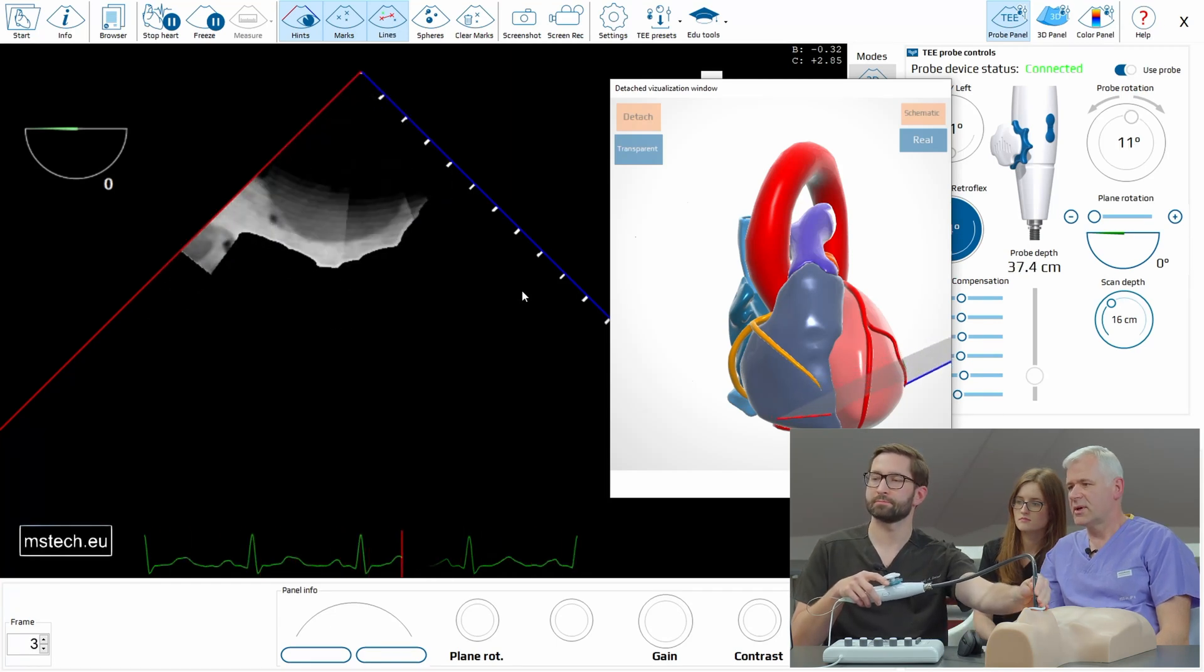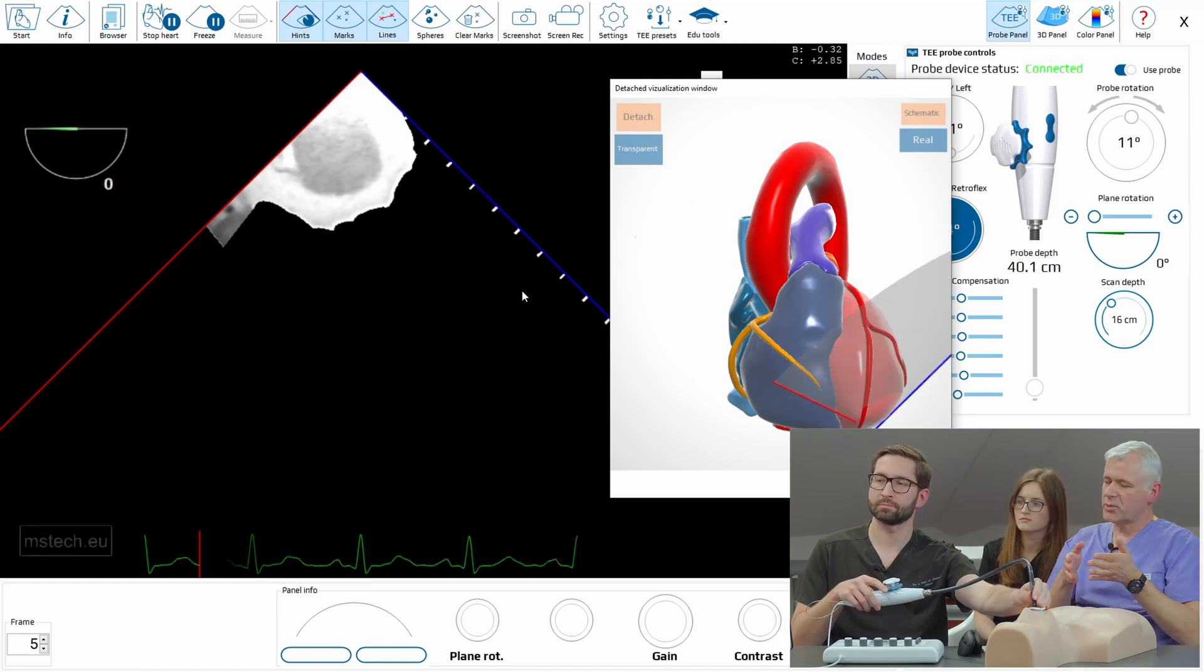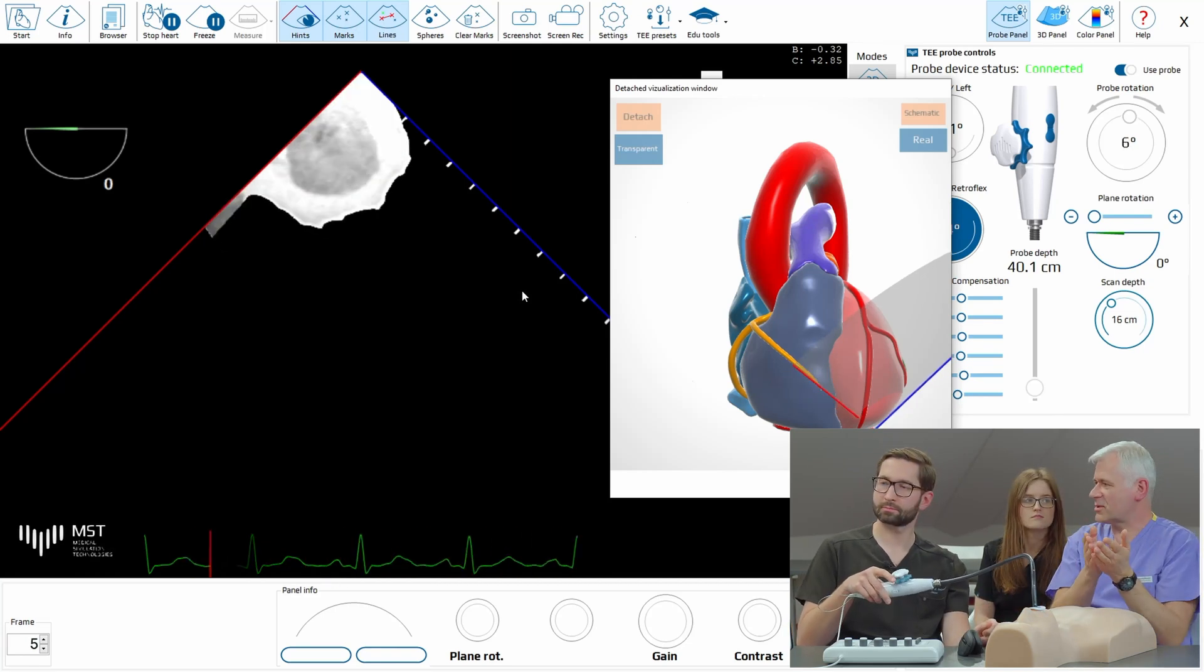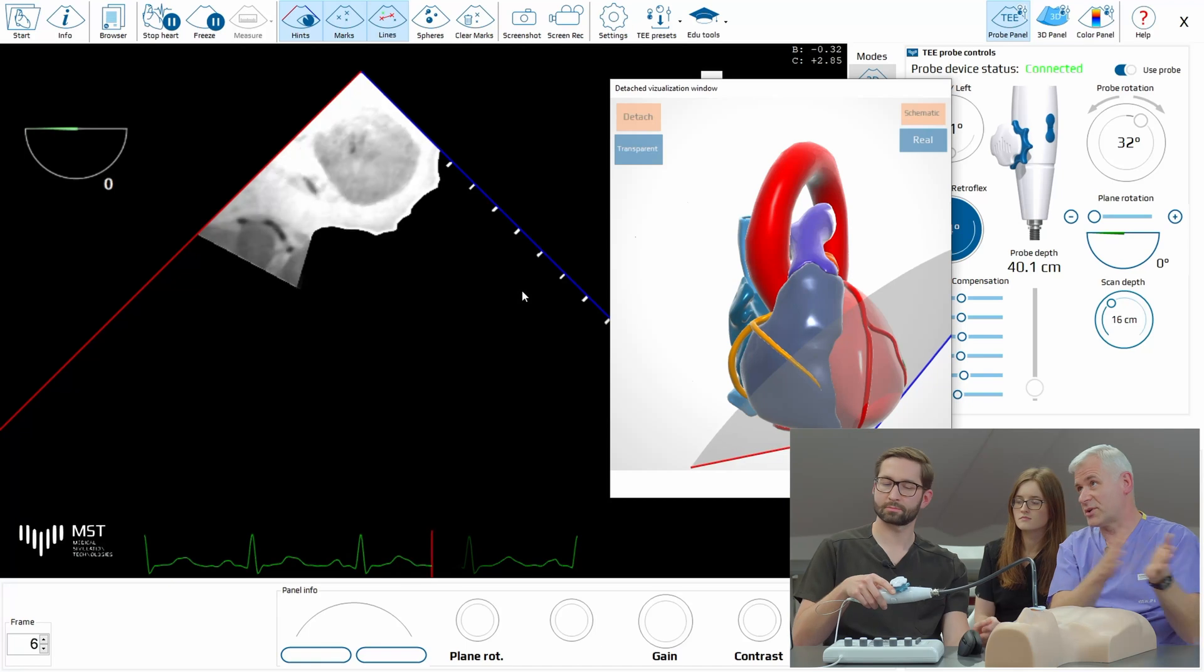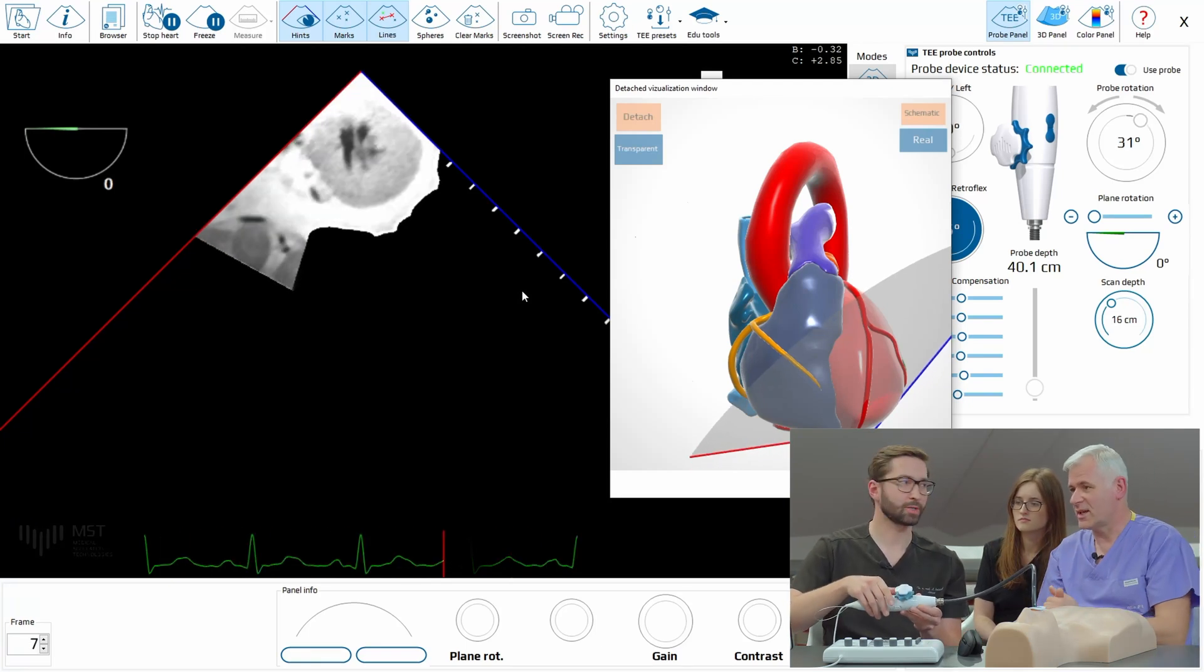Very deep. So now remember when you descend to stomach, always keep the left ventricle visible so you will have guarantee that your probe is going the right direction. If you lose the left ventricle, it means that probably the probe turns somewhere in the stomach and you will not see the apex really.